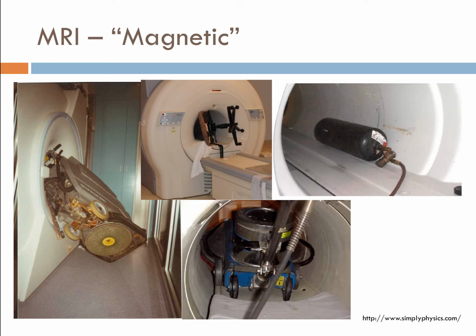I just bring this up because there are people who can't go into a magnet or can't have an MRI scan. There is no real contraindication for CT, plain films or ultrasound, but MR is one of the imaging tools that there is a contraindication to.